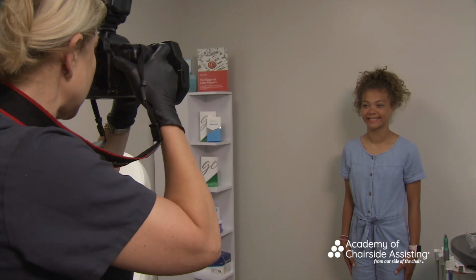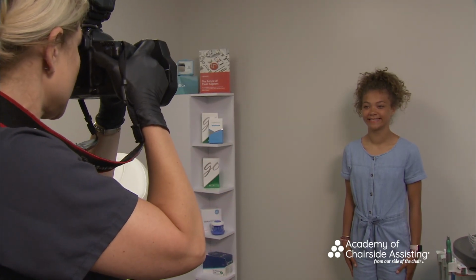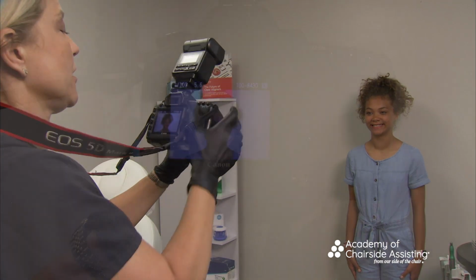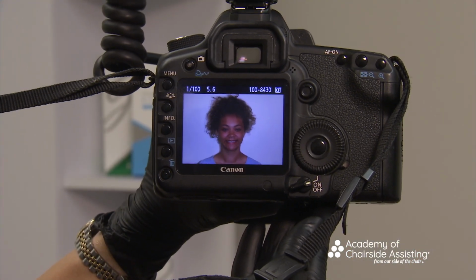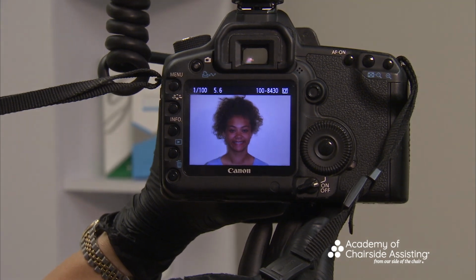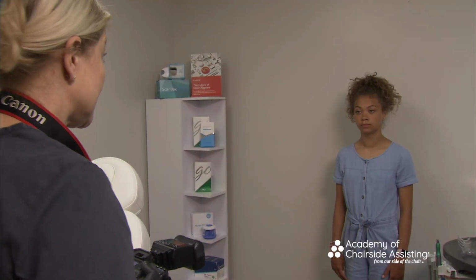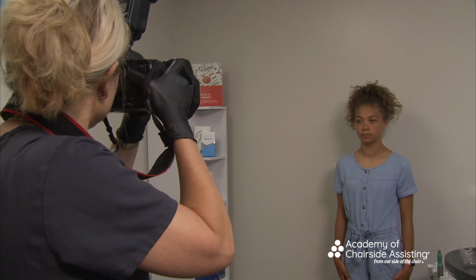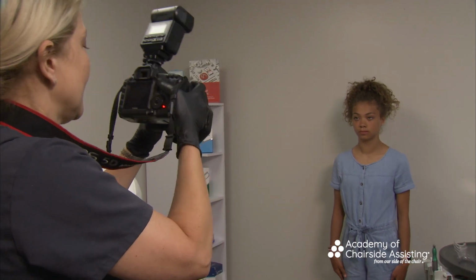So the first photo I'm going to take is going to be straight across, and again, I'm using my grid, getting a really good image here. You can see that we've got from the shoulders up and enough space equal on each side. Now what I'm going to do, Kylie, is have you nose smile, okay? Just like that, and look dead at me. You hear that light?